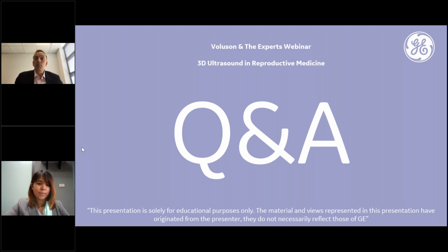But that is a situation where I would potentially look at MRI to try and work out what I'm going to do operatively. Because if you do myomectomies, they can be very difficult operations, and knowing exactly where a fibroid is, particularly if it's close to the broad ligament and you've got risk of vascular injury, or close to the cervix, it can be very difficult to operate. It allows you to have that discussion with the patient about surgical intervention. So I wouldn't even say 10. I think maybe five or more.